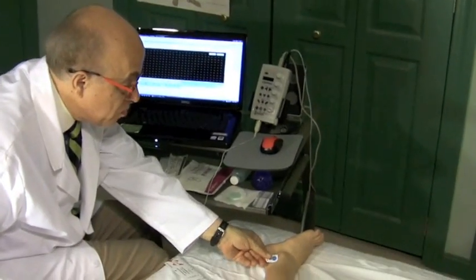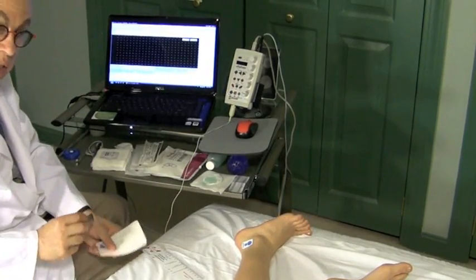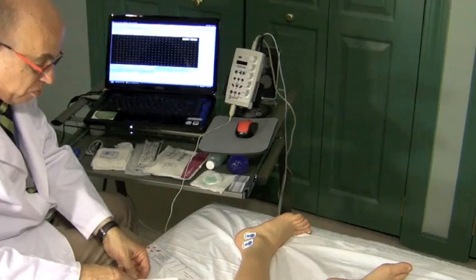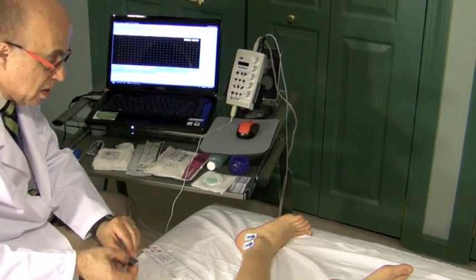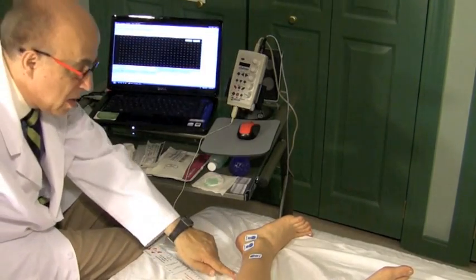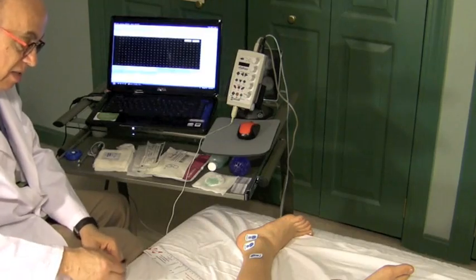I loaded the lower extremity nerves, so it's given me the sural sensory left. I need to put the electrodes on. This is the black, connected to the black. This is going to connect to the red. And this is the green. I'm going to put it between the stimulator and the electrode that's going to be connected to the black or active electrode.